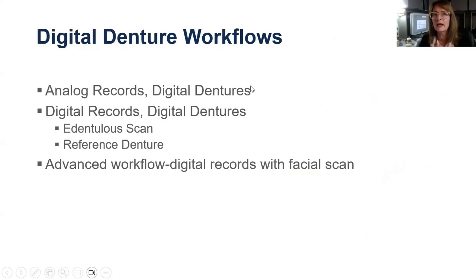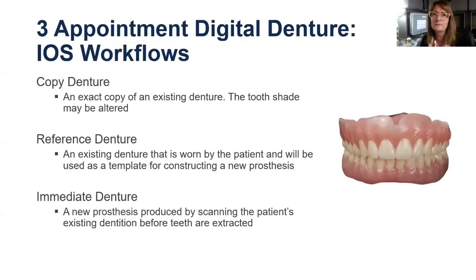So we're going to talk a little bit about what those workflows look like as far as fully edentulous scans and as far as a reference denture. I also threw in more of a little teaser, some images on facial scanning, because we're doing a brand new presentation in January that I'm super psyched about, working with some technicians within NDX, and facial scanning will be part of that. So digital dentures and a 3-appointment digital denture.